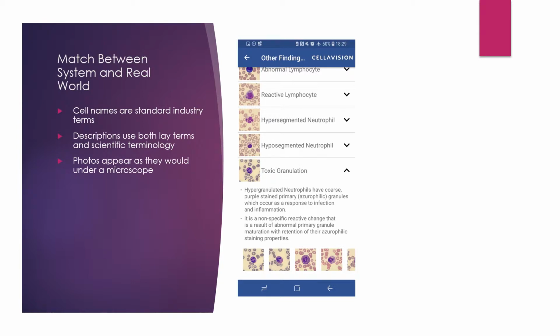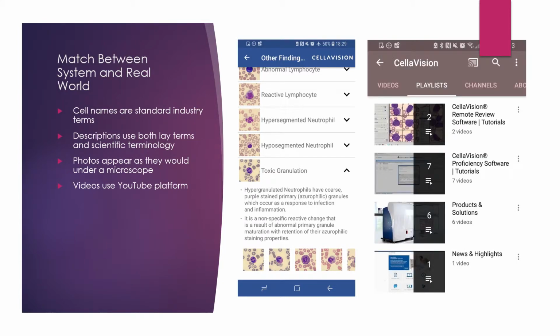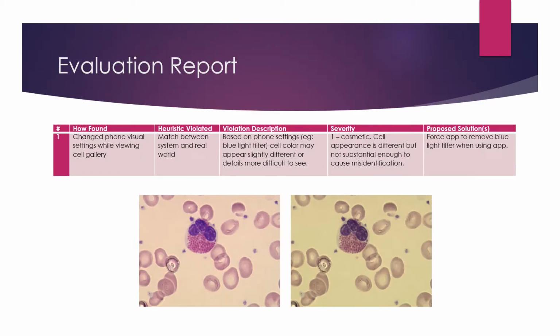And then the photos appear the same way that they would under a microscope. This is exactly what they look like if you're doing a manual differential. And then videos use YouTube platform, so that's really easy to navigate through. And here you can take a look at what the YouTube page looks like. I did find one issue with this.